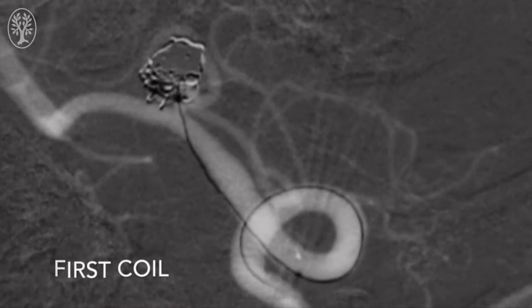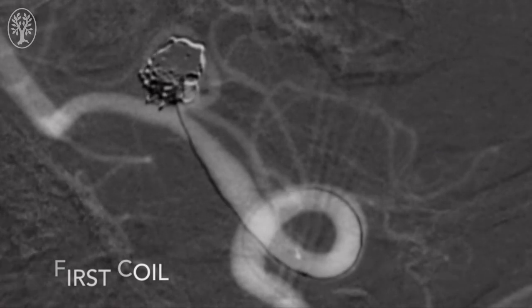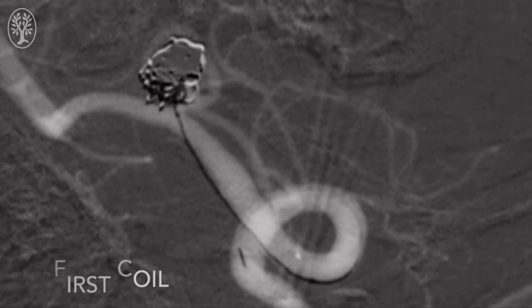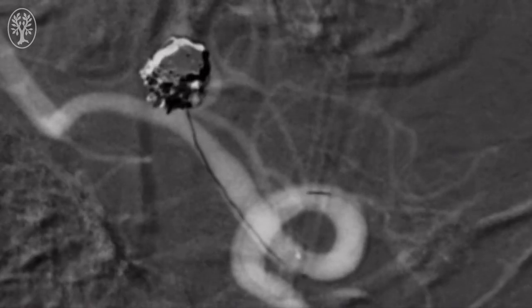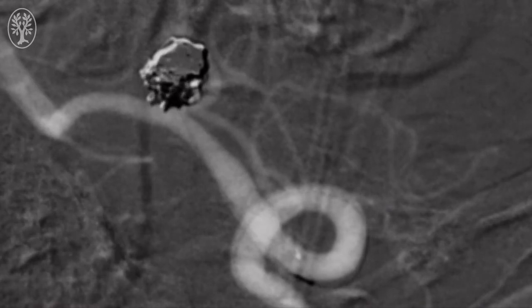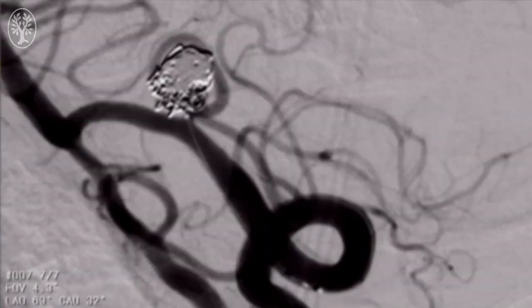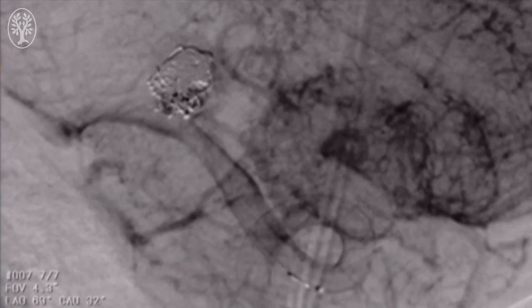Ideally, the catheter is positioned in such a place where there is good painting or back and forth motion of the microcatheter, deploying coils all along the neck recurrence. Angiography here demonstrates new coils placed in the residual neck and persistent patency of the posterior inferior cerebellar artery.